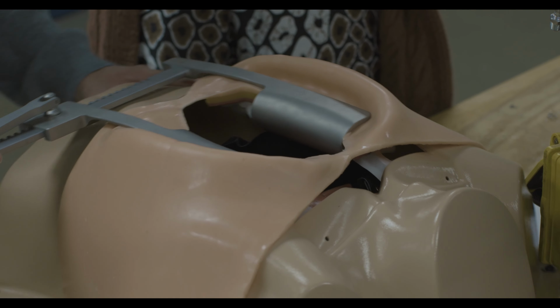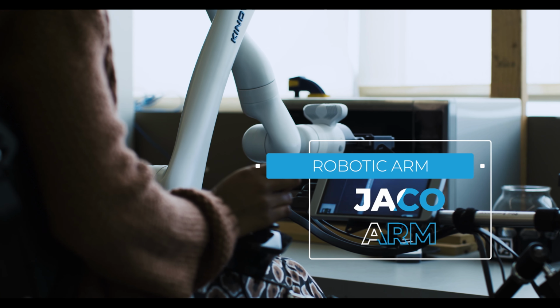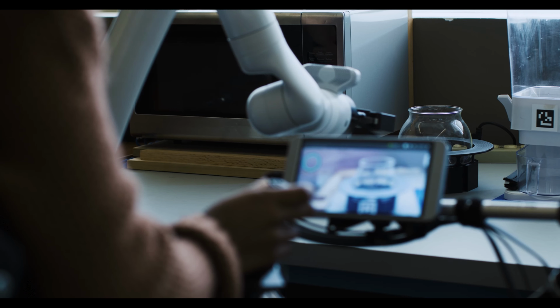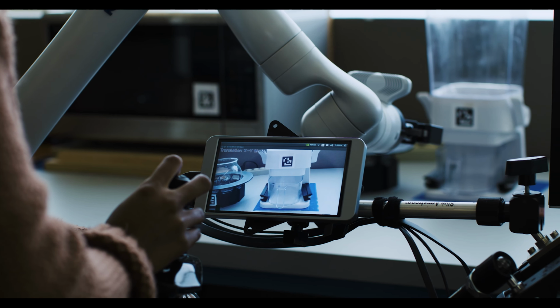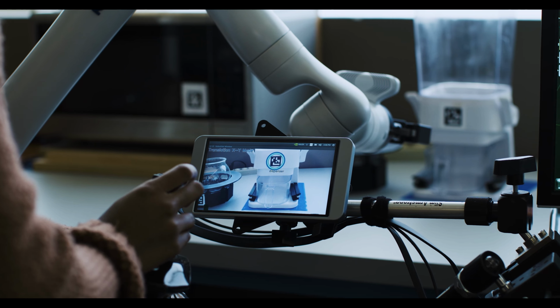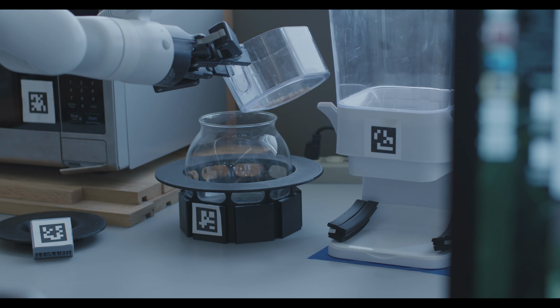Whatever surgery they're simulating. This is a Kinova Gen3 robotic arm. With this particular joystick, we're only using 2 axes. So we've created an interface here where we actually give feedback on which joystick mode you're in. And then in order to access the other joints and modes of the arm, you have to press the buttons on the top. So you're in translation XY, which is moving forward, back, and left, right. So you can try doing that. Forward.